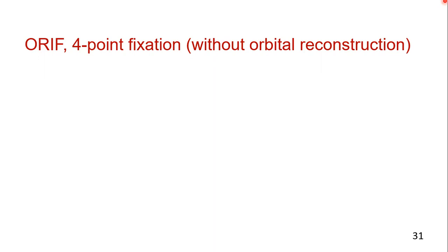The 4-point technique is unique from the 3-point technique in that the surgeon has visualization of the zygomatic arch, because we have to take the coronal approach for the zygomatic arch, and the zygomatic arch can be useful in achieving the proper width of the midface and AP projection of the zygoma. It should be noted that the zygomatic arch is not a true arch and is often relatively straight in its central portion. Accurate positioning of the zygomatic arch addresses the AP dimension and width of the face.